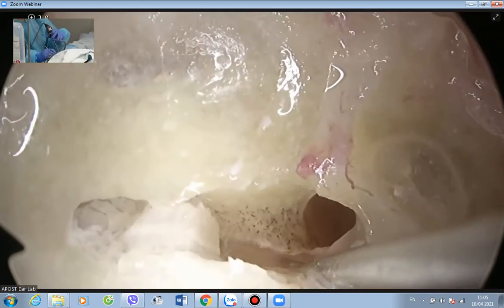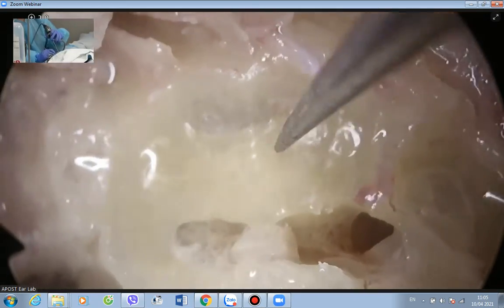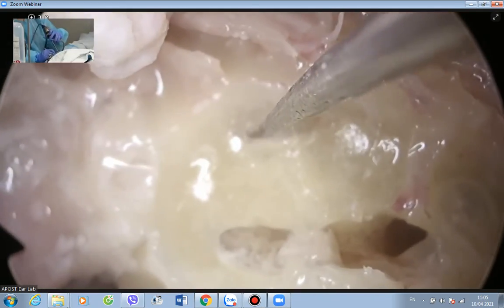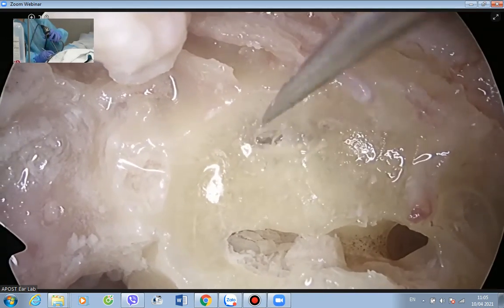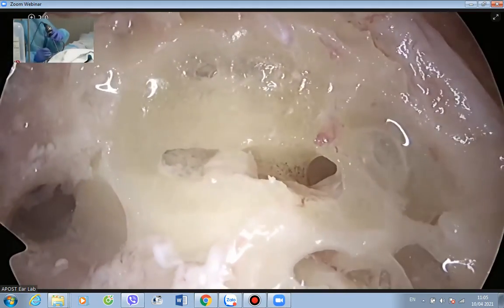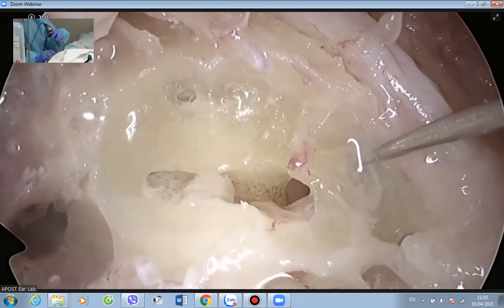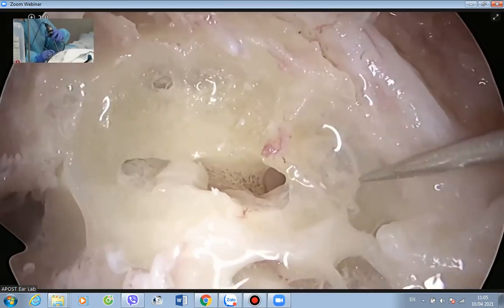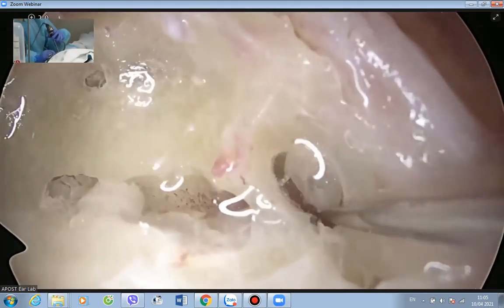This is the tympani, and you can see the hair cells here. Okay. So this is the second turn, to prove this is the second turn. All right. And you appreciate the relationship with the stapes. So this really has otosclerosis. Interesting. Okay. So stapes footplate section.